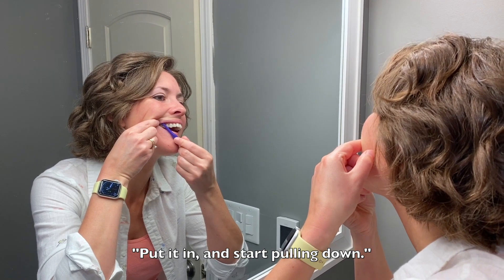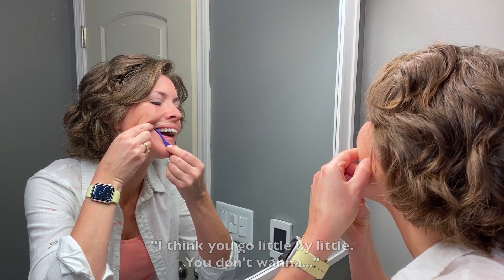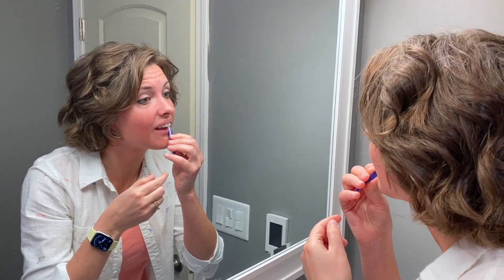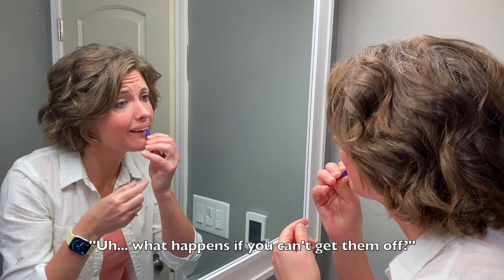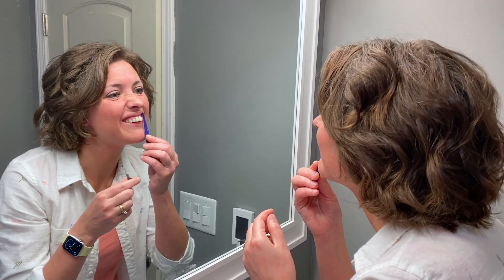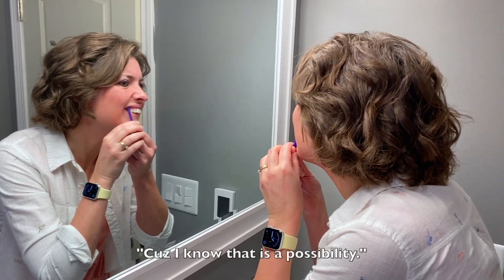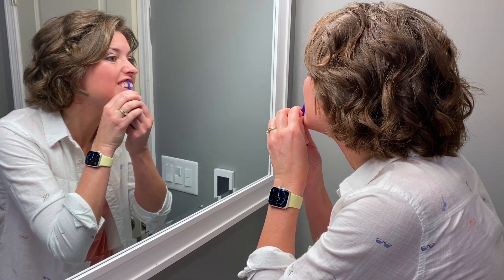And sit in and start holding down. I think you do that kind of little by little — you don't want to... They are on there. Holy moly. What happens is you can't get them off? I feel like they're definitely unseating just a little bit. I don't want to break them, because I know that is a possibility, but get off my teeth!